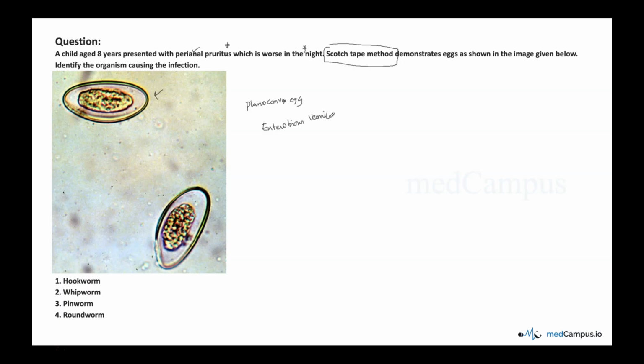Knowing Enterobius vermicularis is also not sufficient for this question. You also need to know that this is otherwise known as pinworm. What are the diagnostic clues in the question? First, the egg is elongated, asymmetrical on one side, that is plano-convex, colorless, not bile stained, thick with a double layered transparent eggshell, and we are using the Scotch tape method.